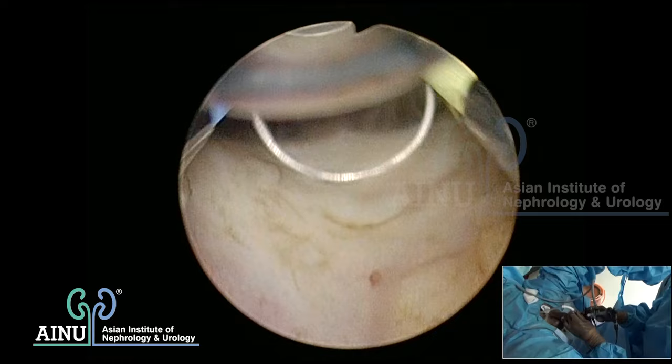The right lobe is almost finished. There are small areas not yet complete which will be taken care of during toileting. Now coming to the left lobe. I want to preserve the sphincter and the liso sphincter seen here. There is a small tissue piece of the right lobe I am going to resect. There's tissue in the roof which I'll decide whether to resect at the end - I usually leave the area between 11 and 1 o'clock to last.